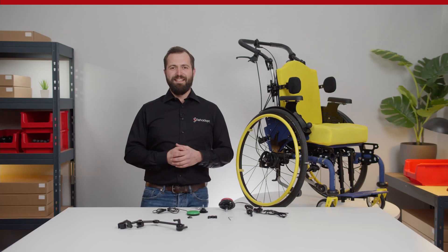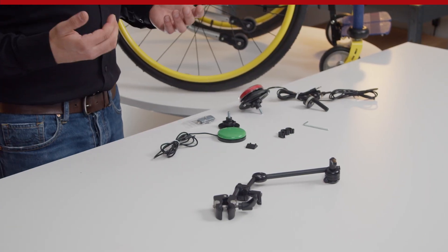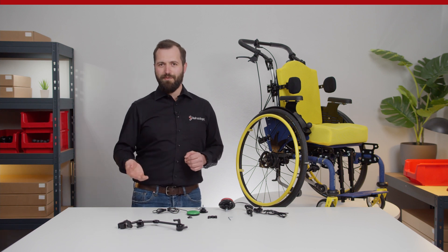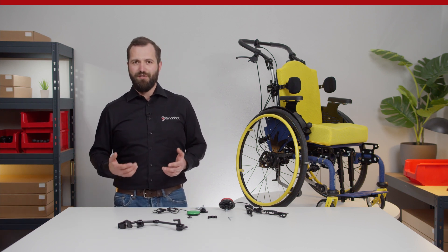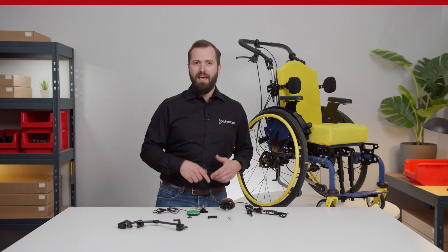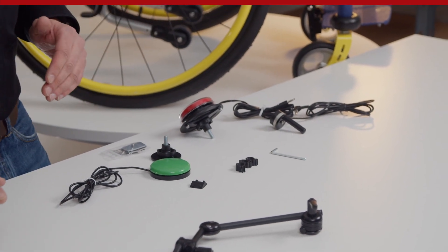However, switch access is also an indispensable element of independent mobility. This is why today I will talk about a universal switch mounting bundle that allows you to successfully position switches such as the Pico button, Jellybean, and the Buddy button onto wheelchairs, tables, and many other surfaces.